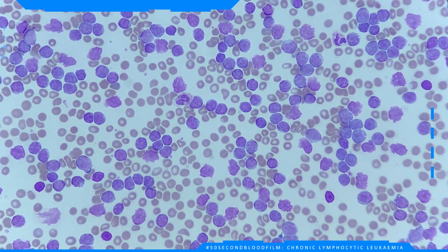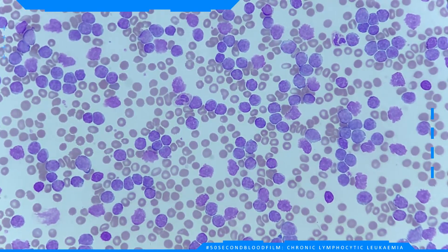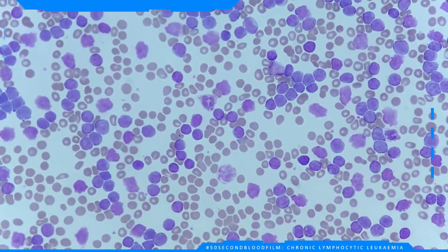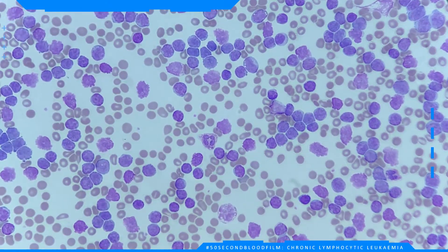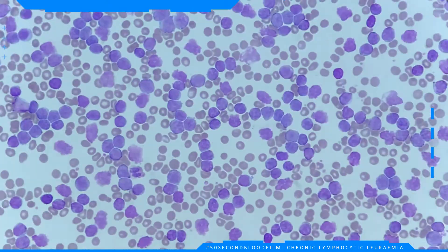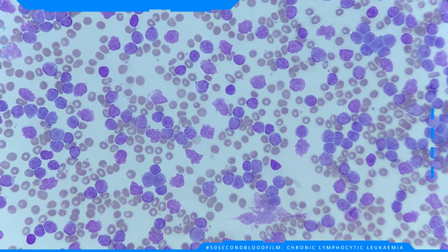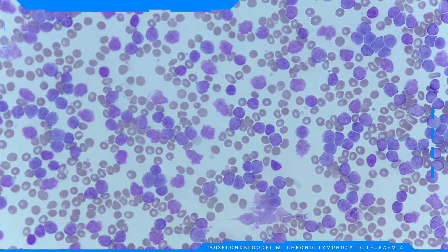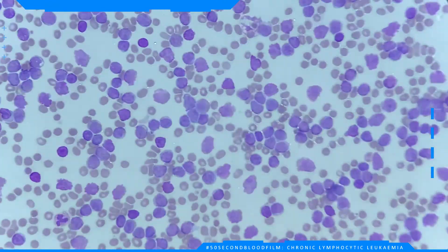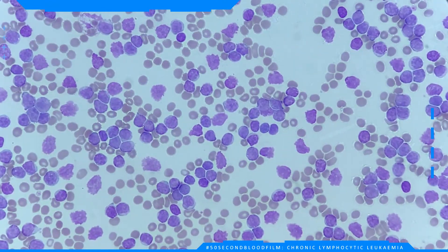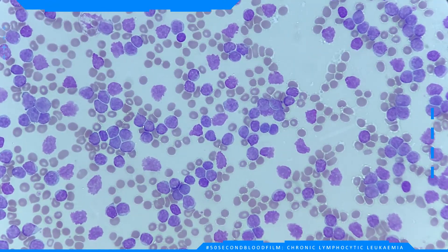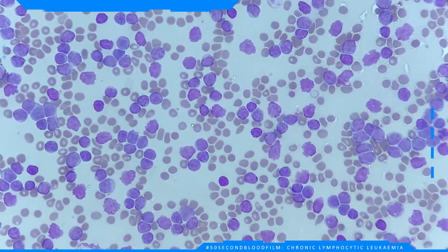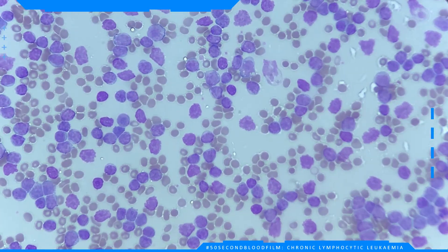All the cells appear to be mature, which can be inferred from the clumped pattern of the chromatin in the nucleus. There are also some smear cells present — an artifact of the smearing process in which fragile lymphocytes become damaged.